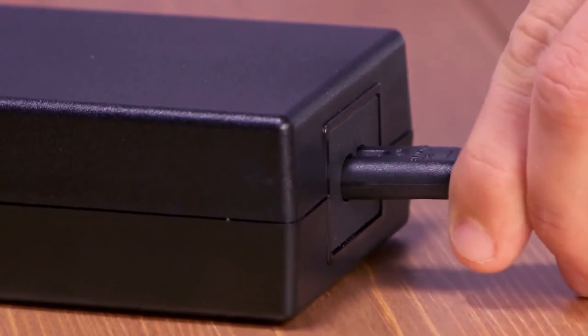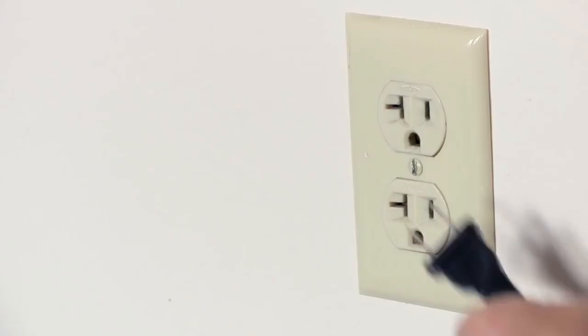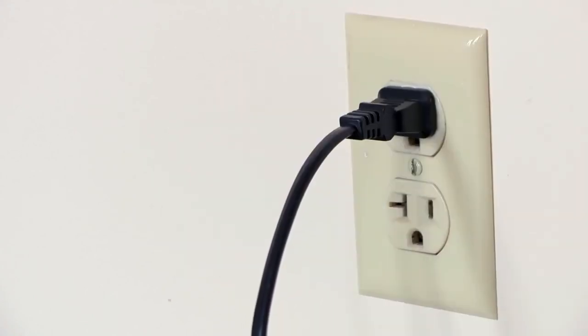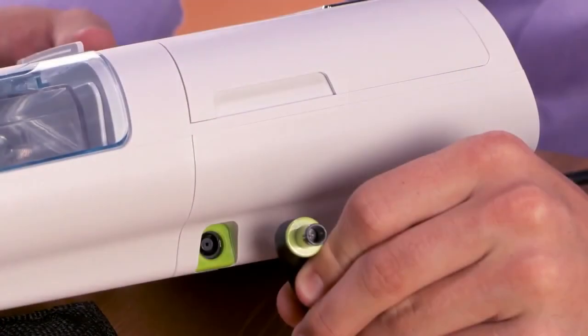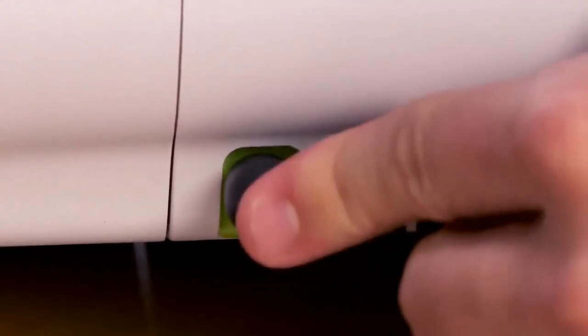For power, insert the socket end of the AC power cord into the power supply. Plug the AC power cord into an electrical outlet. Do not use an extension cord or an outlet controlled by a switch. Connect the power supply cord into the green power inlet on the side of the device. Ensure that the plug is fully inserted.